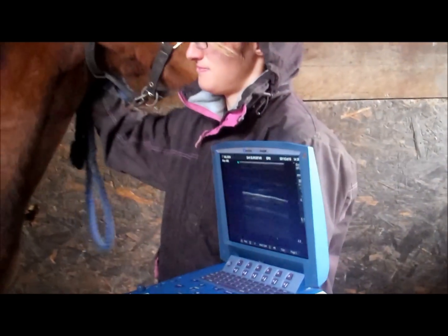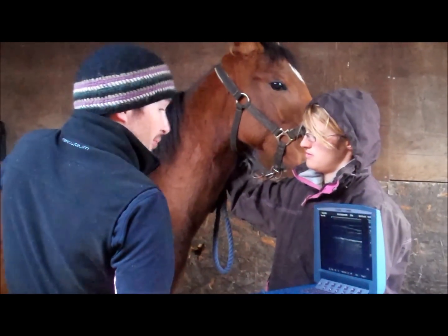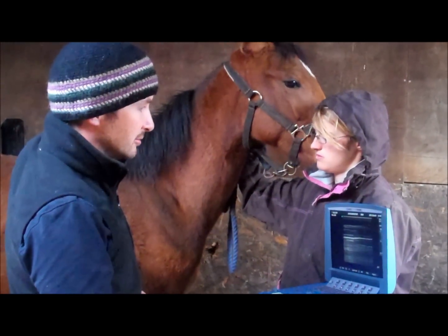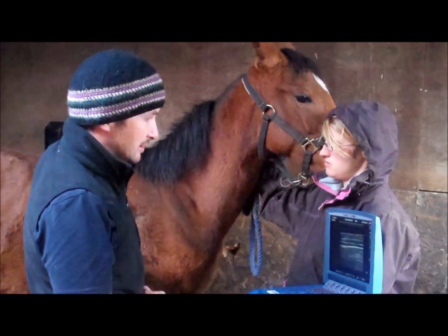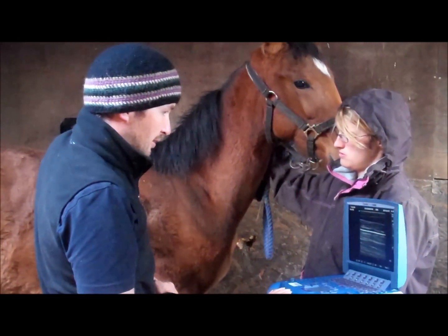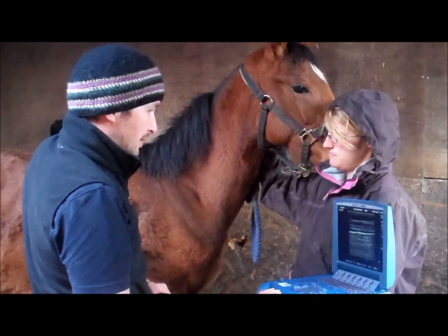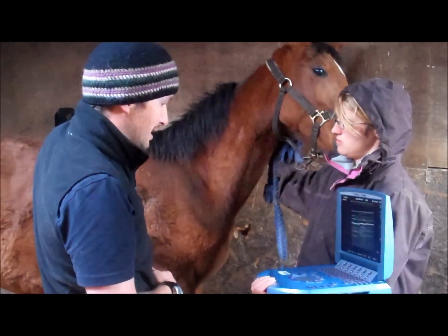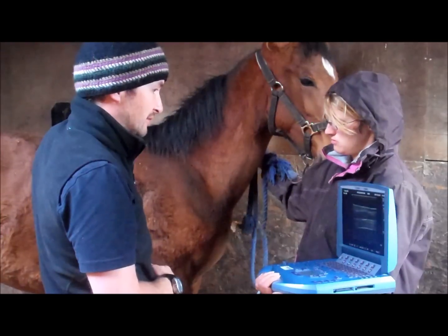Really quite simply and quickly we can screen this horse's chest. That would be really important for a foal with pneumonia if we were looking for Rhodococcus equi — simply just scanning the chest and screening for any lung abscessation. Also in older horses, racehorses, if we think they've got shipping fever or pleural pneumonia, very easily we can just in our first examination put the scanner on the chest and look for signs of fluid.